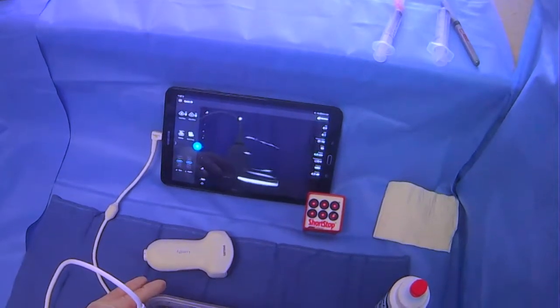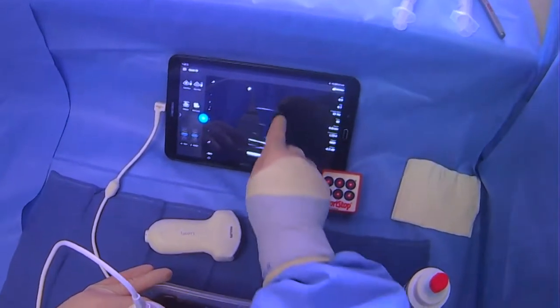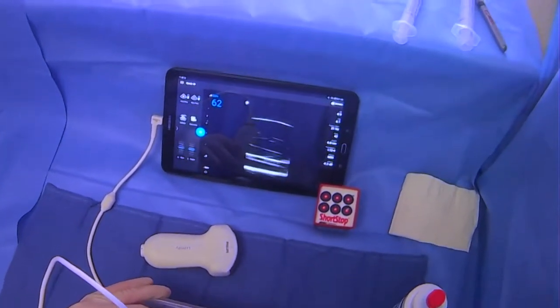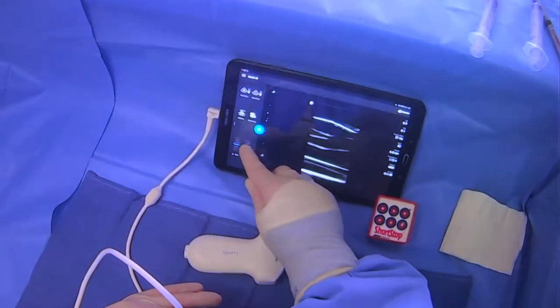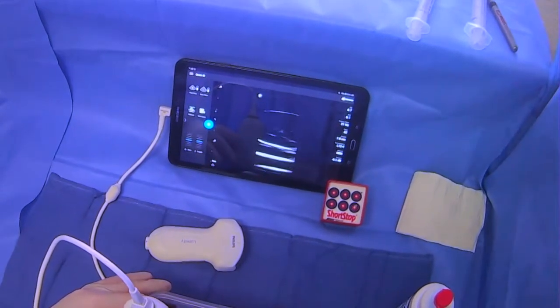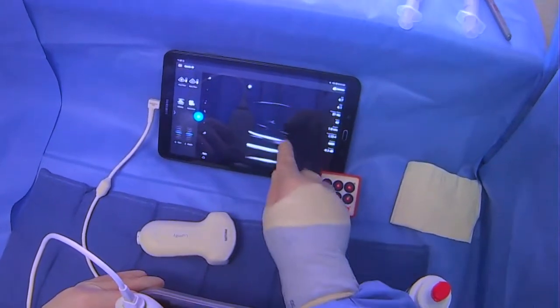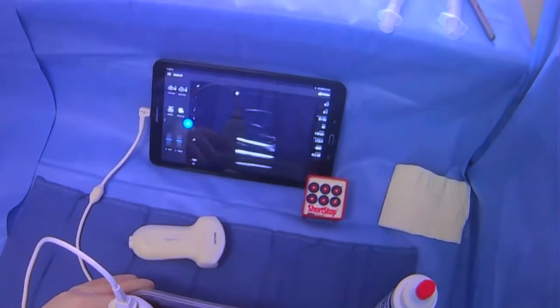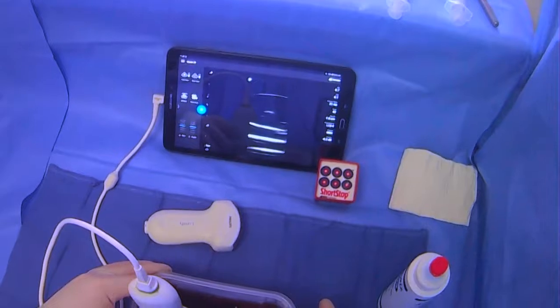When it comes time for the procedure, it can be very helpful if you're doing it under image guidance to use the linear probe — it's a little bit easier to track your needle. Now we have our linear probe, and already we can get a better sense of the collection here. We can see this is the collection right here. Increasing our gain a little bit, scanning through — we can go a little bit deeper as well. We can see this is our ascites right here; these are deeper structures and this is superficial. We get the sense that we can do this with the linear probe, so we'll prep the linear probe when we do the case.